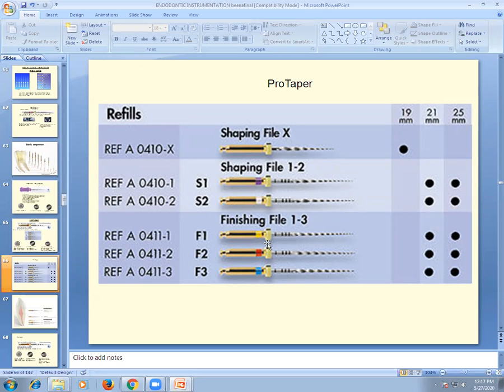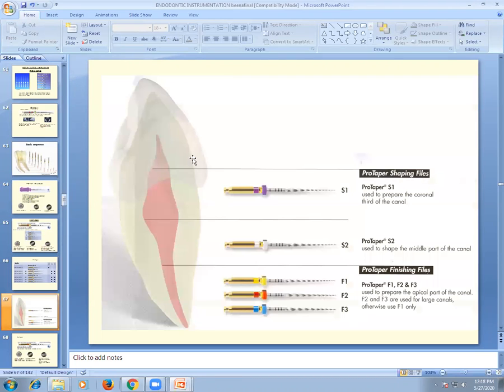Okay, and then the final finishing part is done by the finishing file. So the fluids are a little blunt, you can say, with the finishing files. See how to use the files now. You know what are the rotary files, what are hand files, how are they used. These are to be used with the endodontic motors. Hand files can be used manually, but where and how to proceed with the files.